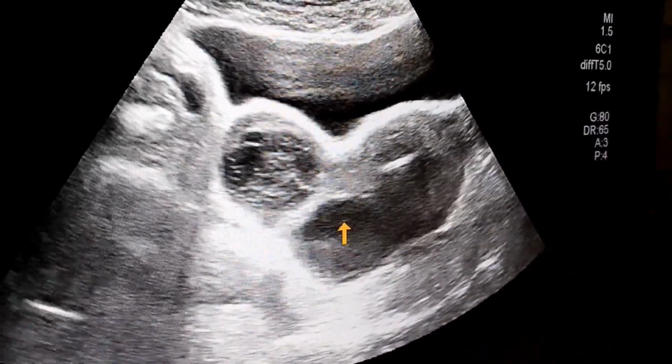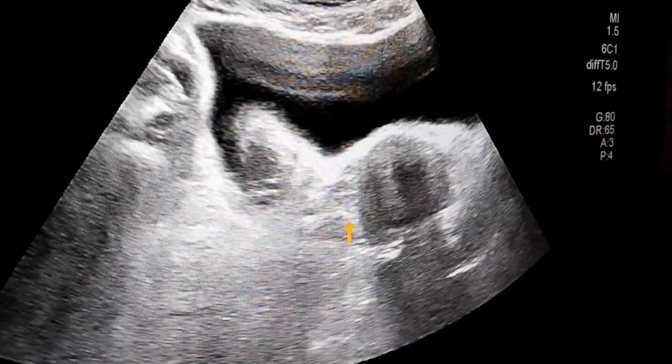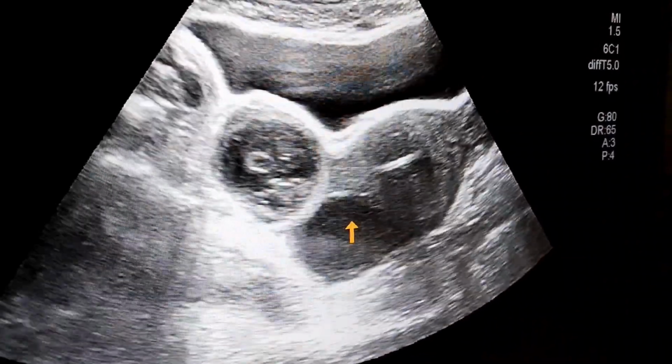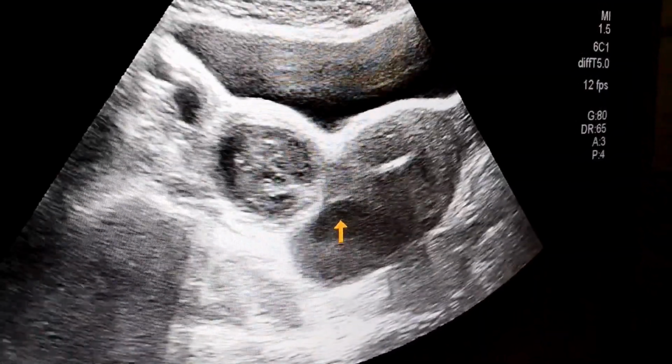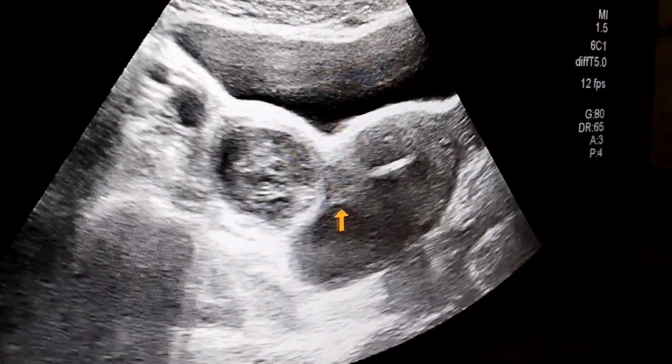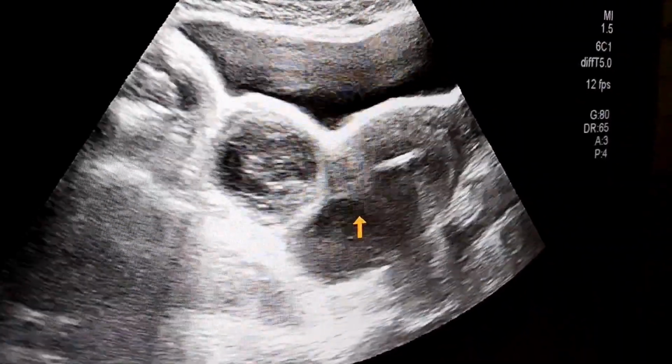So in conclusion and impression, we can say that there are two cystic lesions occupying the right ovary that are very close to the fundus of the uterus, while one seems to be adherent to the fundus of the uterus.